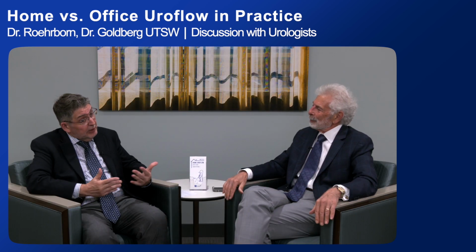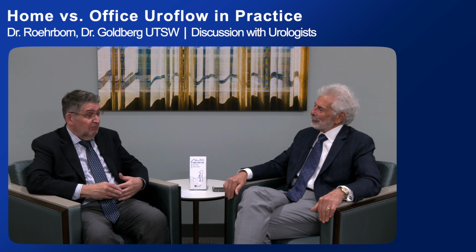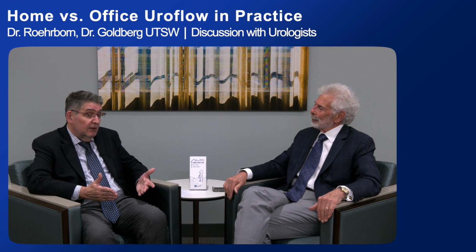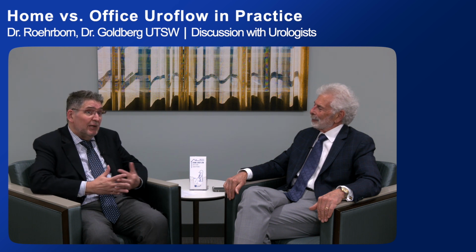In preparation for this conversation, I just had a patient in my office this week who had a TURP. I thought he had a good TURP. Everything went well. He came in for the flow rate. He probably wasn't ready. He had a little nervousness, anxiety. And I'll play a little video. I think that highlights the problems we are facing.